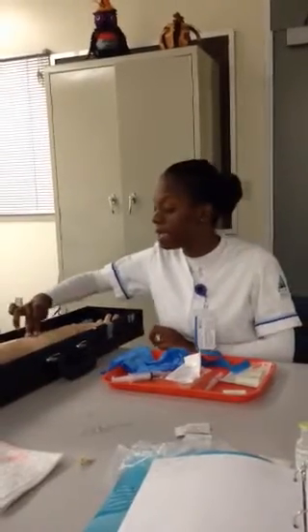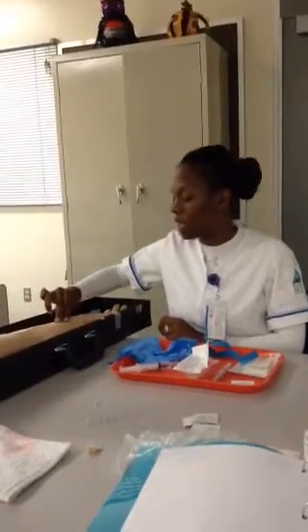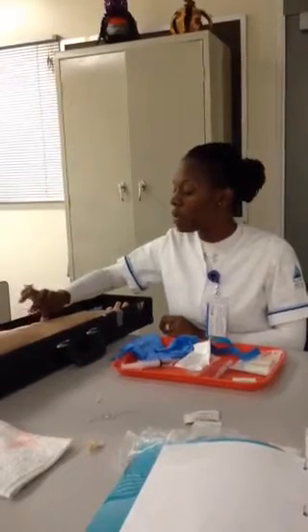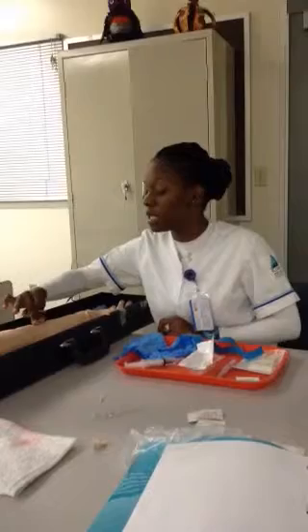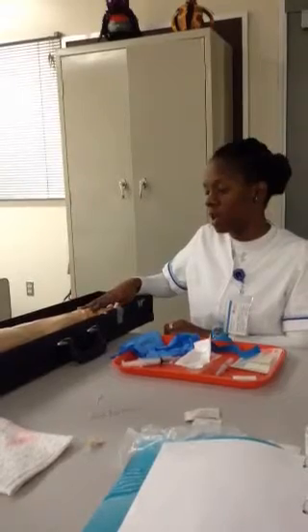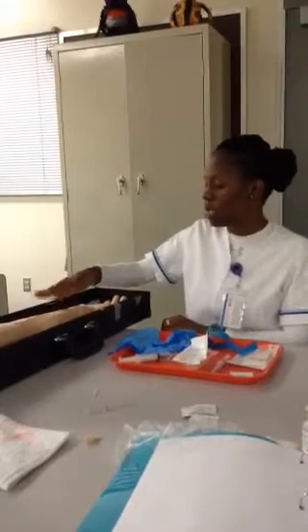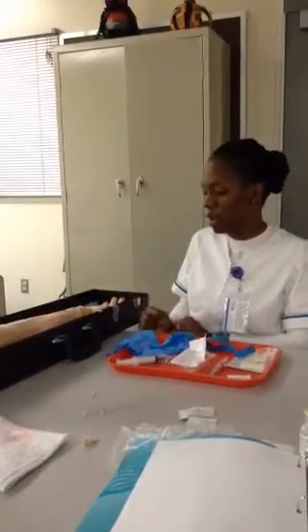Do you have any pain in this arm? No, ma'am. Why am I feeling here? I'm feeling here because we're going to do an IV insertion. I'm going to use this vein right here because it's very spongy, bouncy, and resilient. We're going to use your right hand because that's your non-dominant hand, as you told me before. There's no pain or tenderness here, and it's most distal, so this will be the least-used hand for any ADLs you may perform.